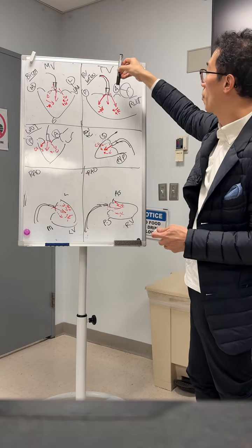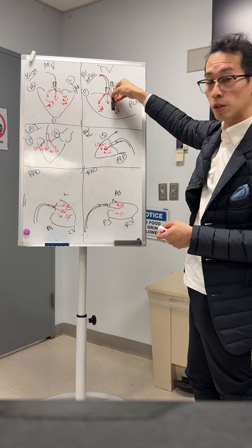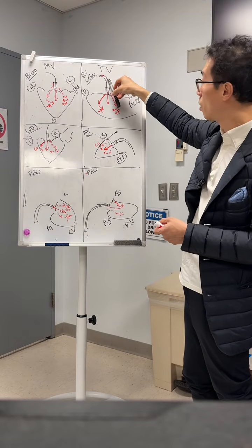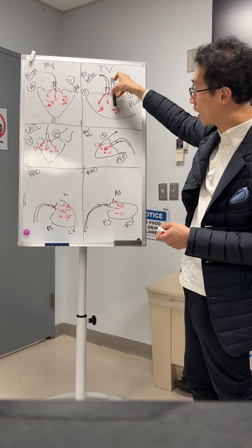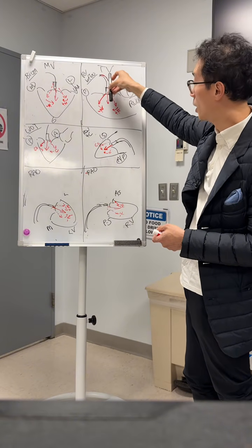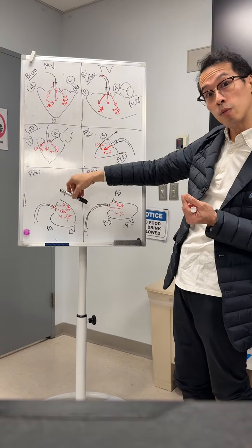Okay? Same thing here, same principle, just the knob is different now. So you should go straight into the right ventricle. If you're going towards the anterior septal commissure, you add flex. Okay, if it's going to the posterior, the free wall, you minus the flex so that it moves more straight. And then this is the same as the fluoroscopic trajectory. Same thing here on the fluoro, you should see going in without the clip, without parallax.